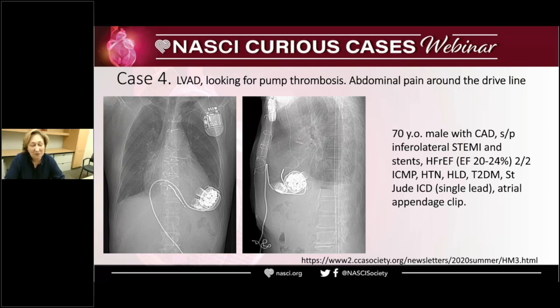Okay. So why do you think that's HeartMate 3? Well, that's correct. That's correct. I mean, just going by probability. I think these days we don't really do HeartMate 2 anymore, or HVAD. So I'm just guessing it's HeartMate 3. Right. Okay. So the inflow cannula, outflow cannula, right? And then the driveline.